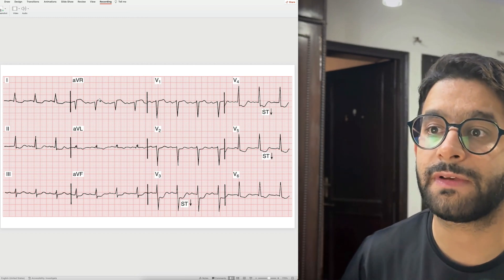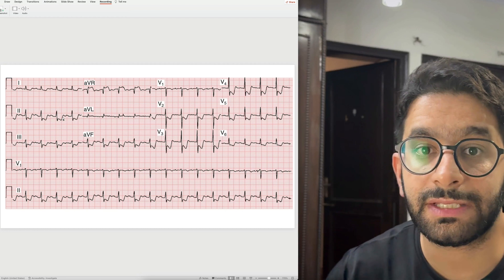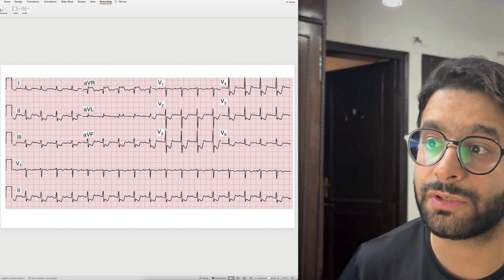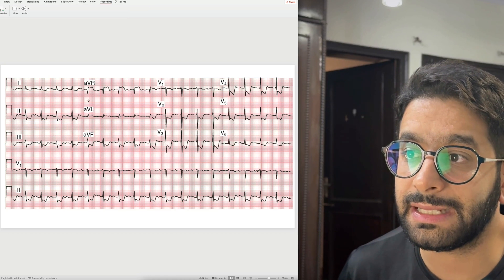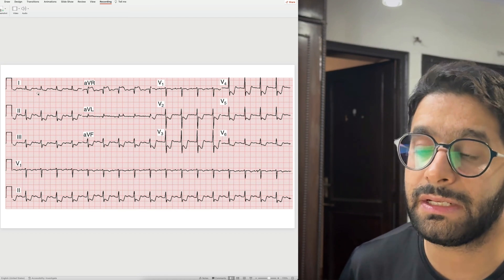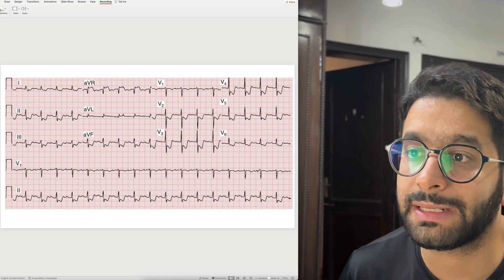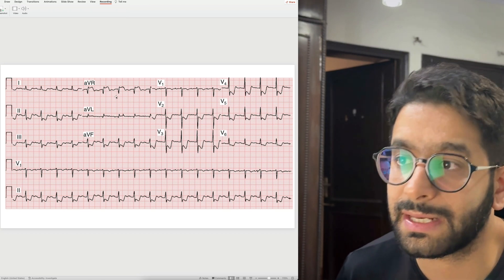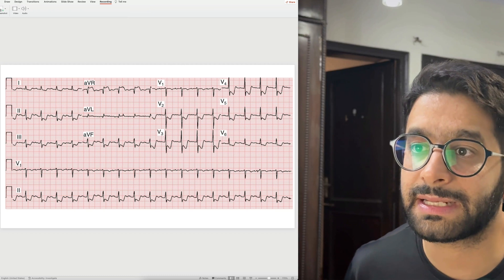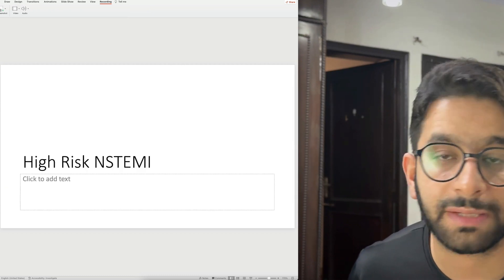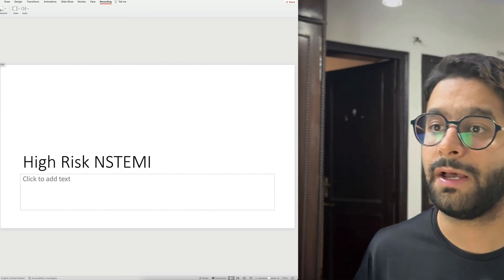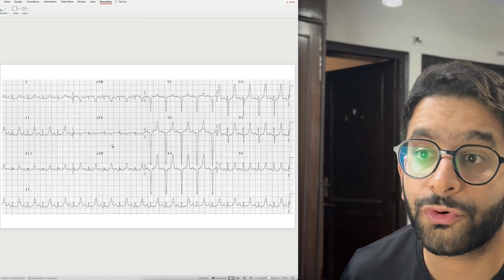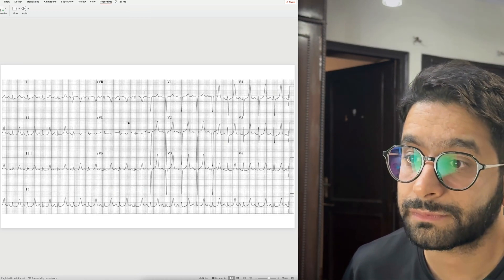Remember: if in a case of chest pain, aVR is elevated and the majority of other leads have ST segment depression, this is an extremely high-risk ECG. It means the patient has either a left main disease, a very proximal LAD disease, or all three vessels of the heart are diseased. Here's an example of an ECG of a patient who had left main occlusion — ST segment elevation in aVR with diffuse ST segment depressions in all remaining leads. This would be categorized as NSTEMI but it is a high-risk patient.